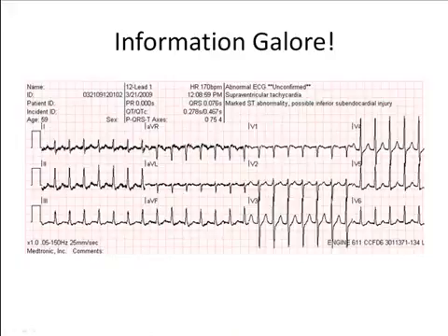When interpreting a strip, it is best to be organized in your approach and thought process. This way, simple things will not be overlooked. Almost all of these observations are accomplished quickly, especially when taking full advantage of the information that is provided to you on a typical LifePak 12 or 15 printed strip.